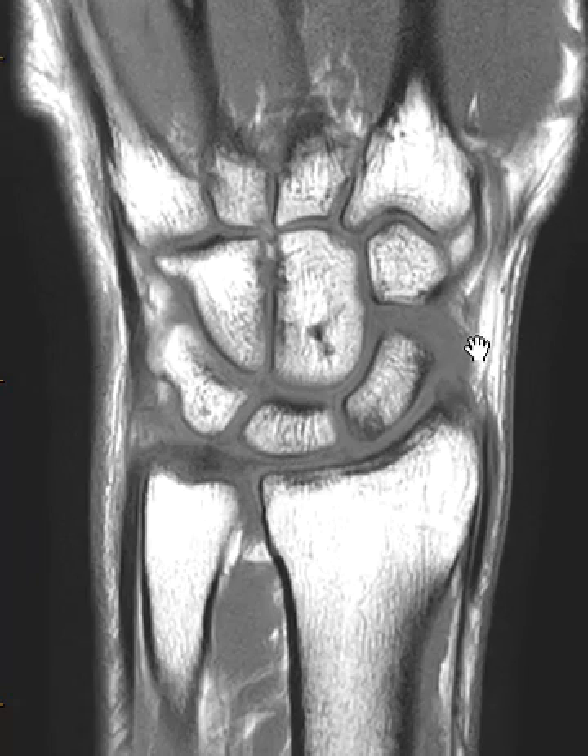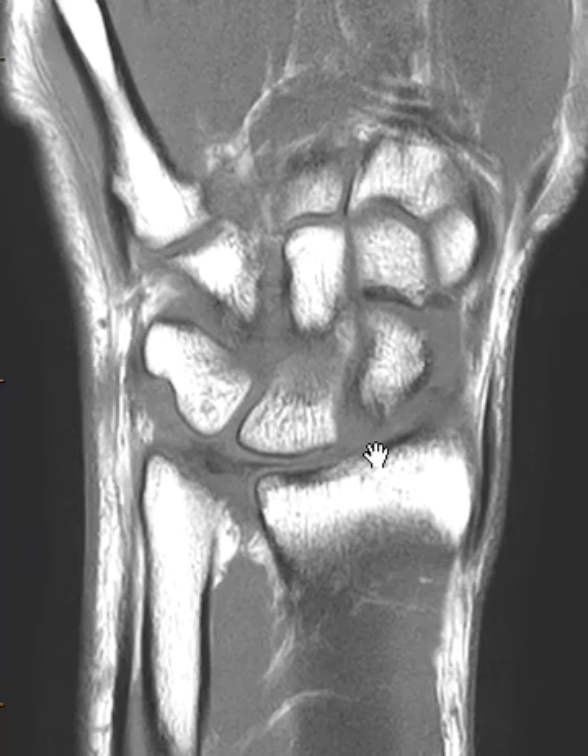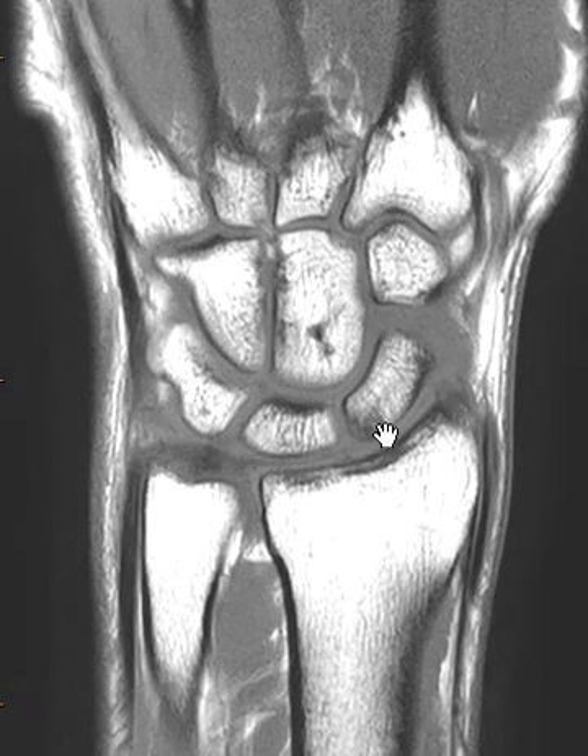On this coronal T1 image, we see that they do have some low T1 signal beneath the articular surface here in the base of the lunate. This may be related to a cortical impaction injury or a periosteal avulsion type injury at the scapholunate ligament attachment. There is no scapholunate widening. This is the scaphoid bone, lunate bone, triquetral bone, and here is the capitate bone.